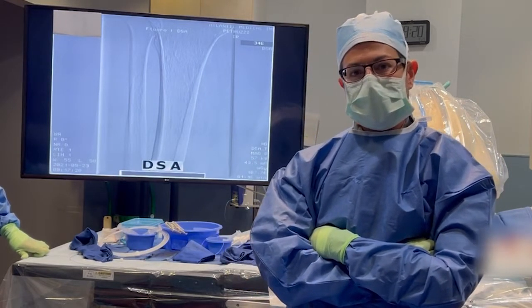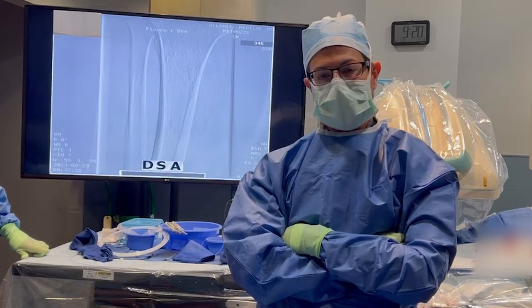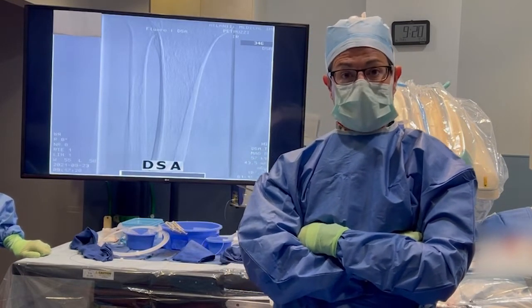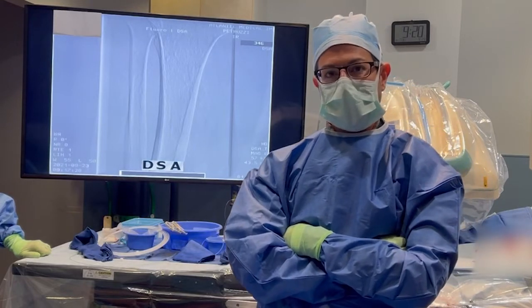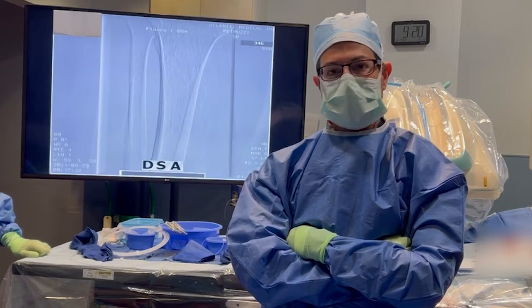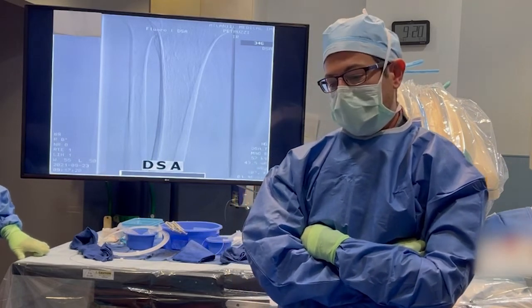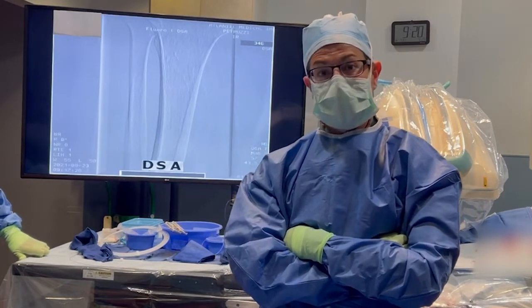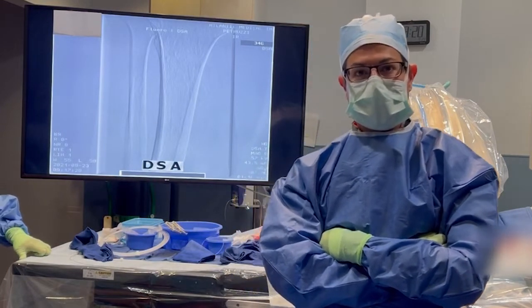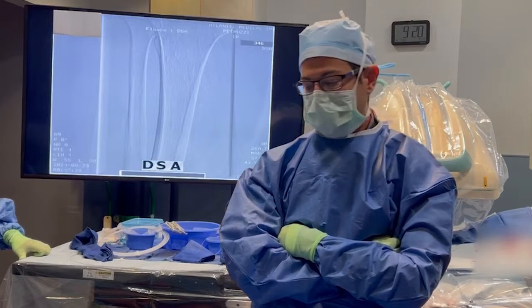Today, I'm going to go over and present to you a case of peripheral arterial disease, and this is what's called an angiogram, where we perform a minimally invasive technique just through a needle puncture in the skin, an outpatient procedure, which allows us to see the blockages in the arteries, and then right then and there treat the blockages in the arteries to restore blood flow.